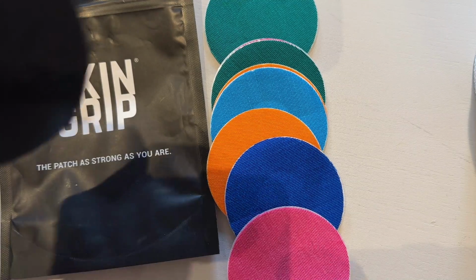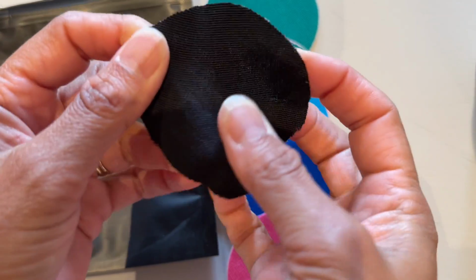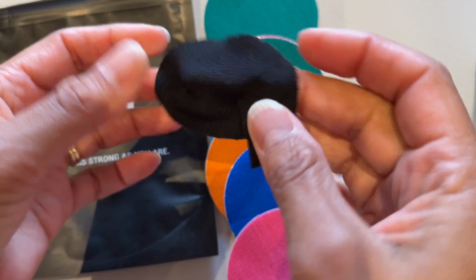Just as with Dexcom G7, Dexcom wants you to add the overlay tape that comes in the pack to your Stelo to secure it so it won't fall off. I do not do that because this tape makes me break out in hives. Instead of using the official Dexcom tape, I use a tape from a company called Skin Grip. I like them. They're gentle on my skin and they keep the sensor in place.